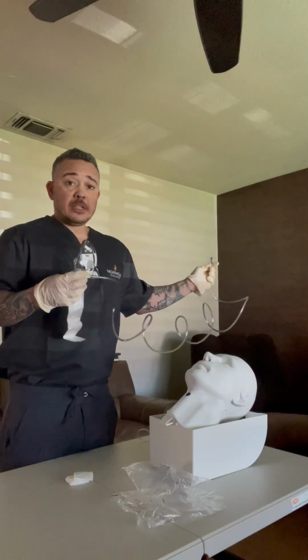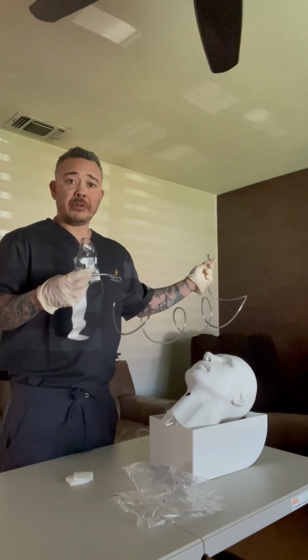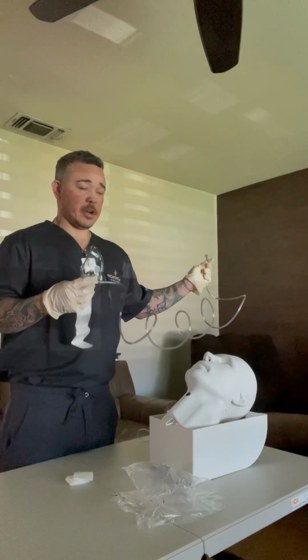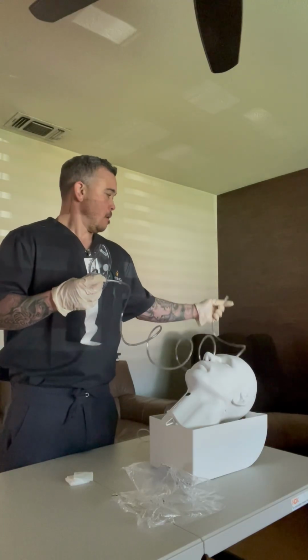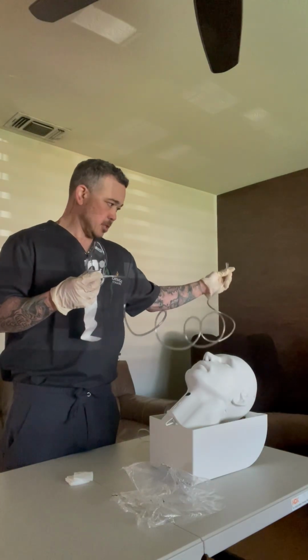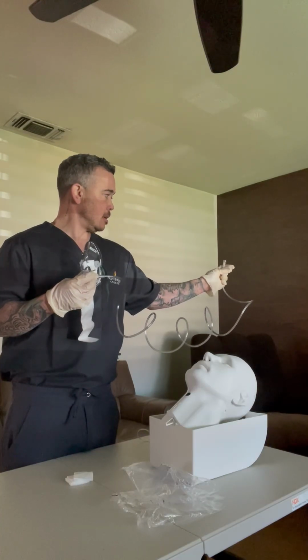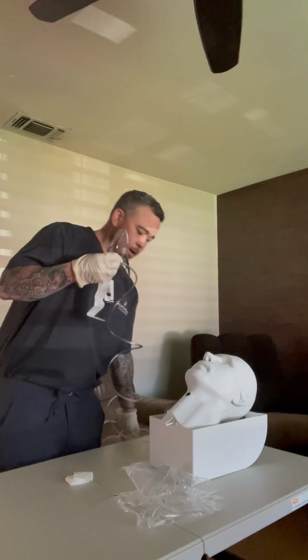The normal range for the non-rebreather mask is between 10 to 15 liters. For the purpose of this exercise, for the skills video, we're going to state that the doctor prescribed 10 liters, okay? All right, I have that inside. I have that attached to the flow meter, and I adjusted the level to 10. You can see the balls right there, okay?